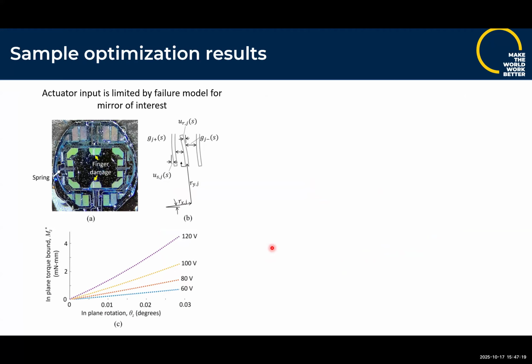For this particular instrument they were working on, we had a mirror that was intended to be roughly elliptical, and it's rotating back and forth in 2 axes. And the limiting factor is that these comb finger arrays are attracted to one another. And if they move unwantedly off axis, they will crash at too high a voltage. It's called electrostatic snap-in or pull-in. And this is a device where that's happened. It has arced current where the crash occurred, spewed metal all over the place. That's all these particles we see, and that mirror is not going to work very well.